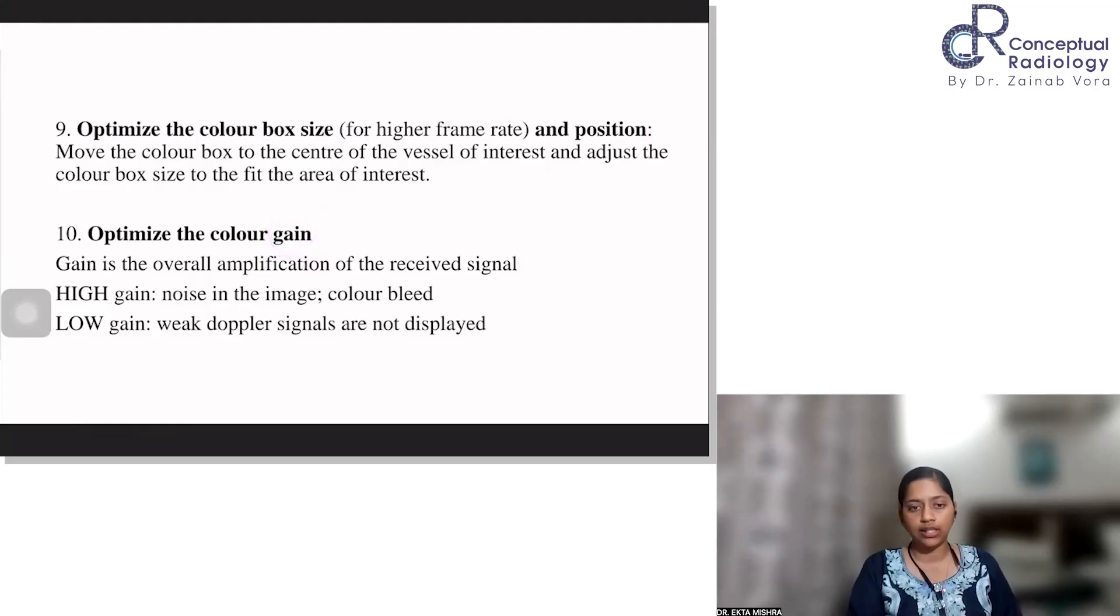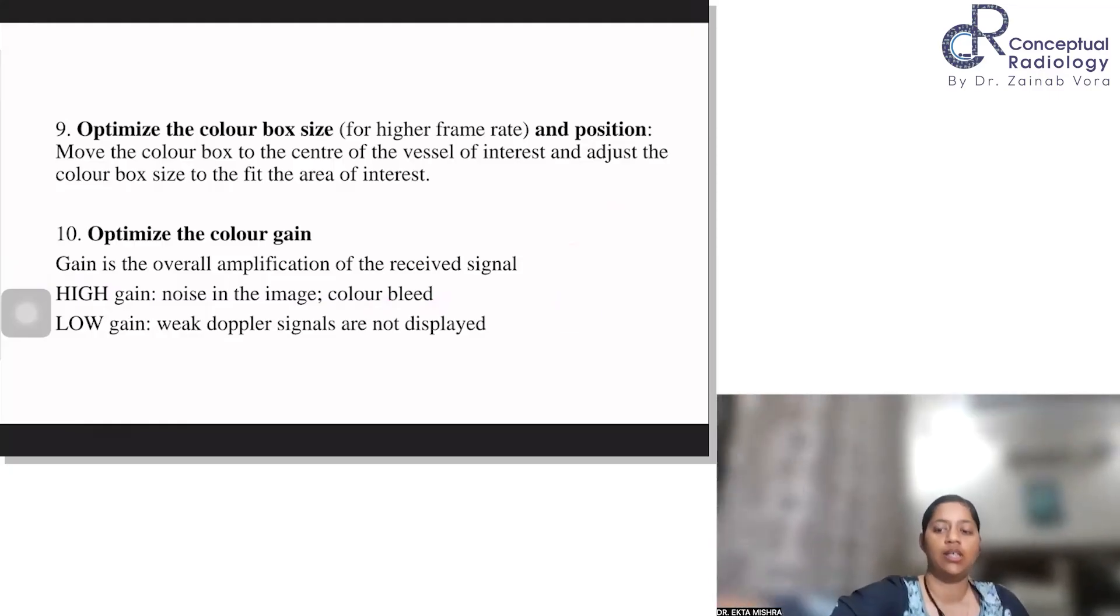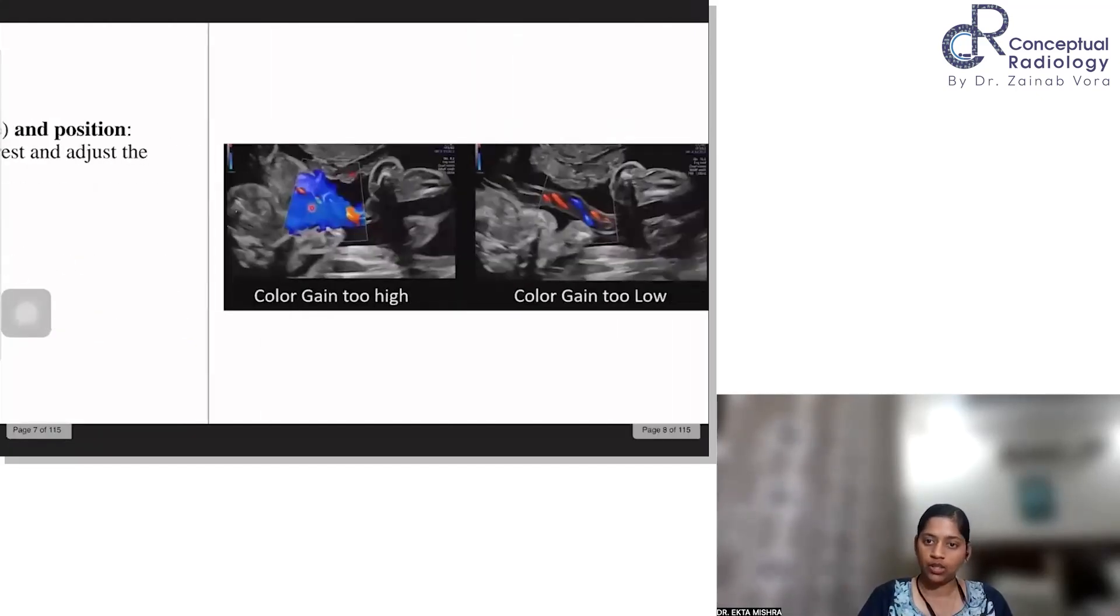Then the gain. As you do for B-mode imaging, optimize the color gain accordingly. Just turning the knob would adjust the gain. Gain is basically the overall amplification of received signals. So if you're receiving this signal, when you turn on the knob for color, the signals would be amplified and hence you will see them more clearly. But if you have very high gain, then there will be noise in the image and the color will start bleeding out of the vessel. And if your gain is low, then the weaker Doppler signals would be left out. So you have to mix and match and adjust accordingly.